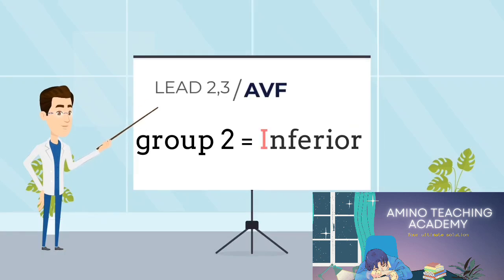Group 2 includes lead 2, lead 3, and AVF. They correspond to letter I, which stands for inferior. So ST segment elevation in these leads corresponds to myocardial infarction in the inferior wall of the heart.